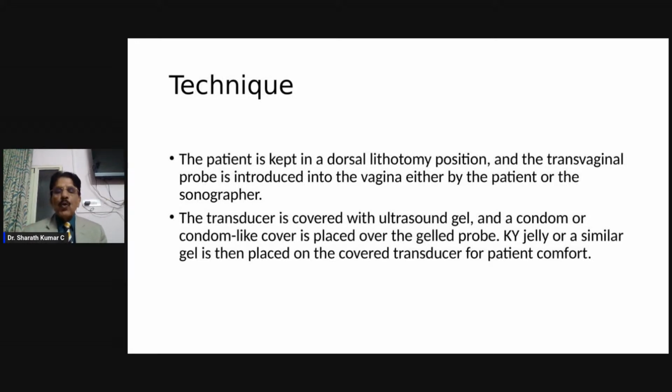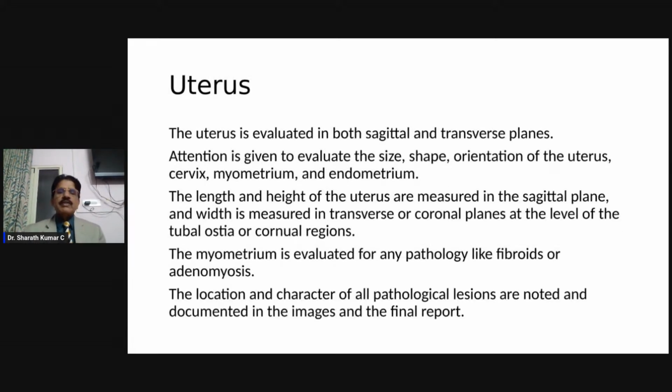And gel has to be put over the condom also. KY gel or similar gel is placed on the cover transducer for patient comfort. And if there is pain, you can use even xylocaine gel. Uterus is evaluated in both sagittal and transverse planes.